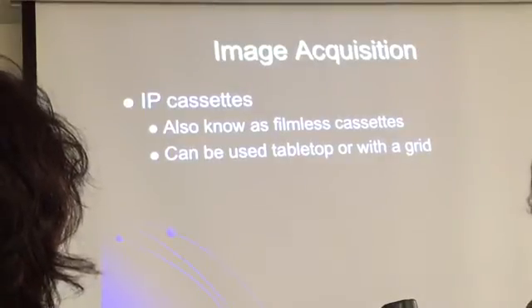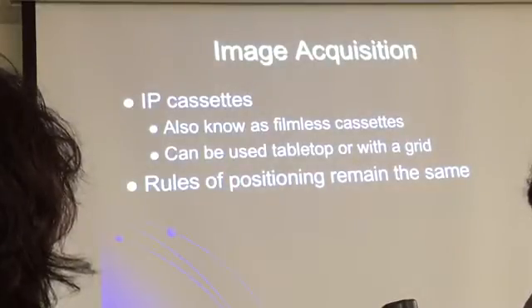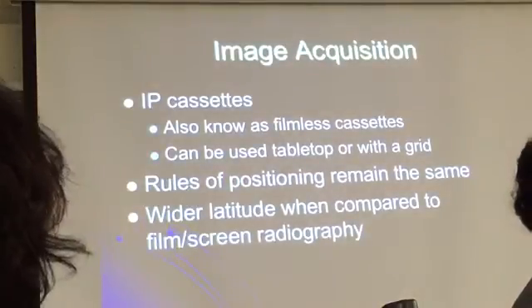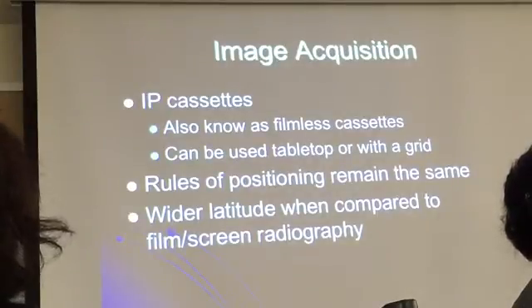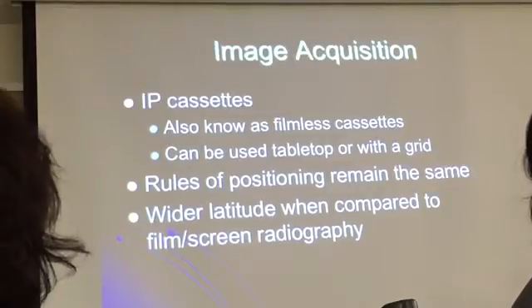So many benefits. Rules of positioning remain the same, just like what you did with cassettes, and so it was easier too. This is another side note. It was difficult for technologists when this technology became common.